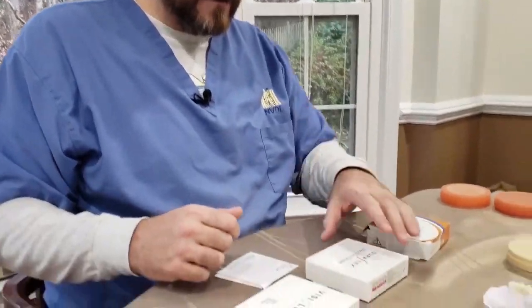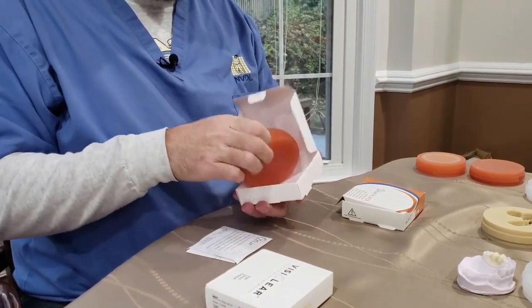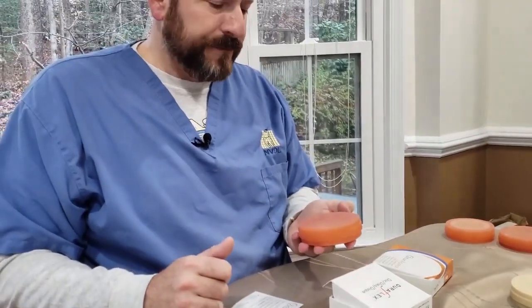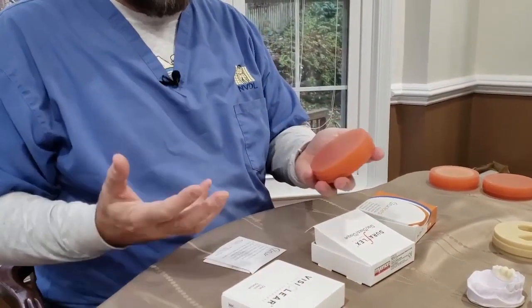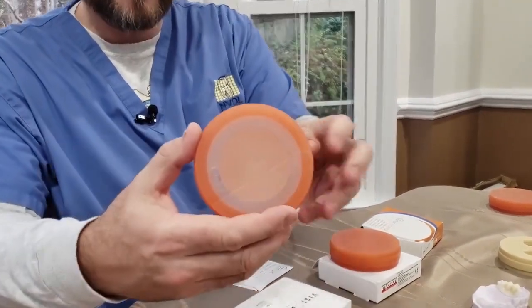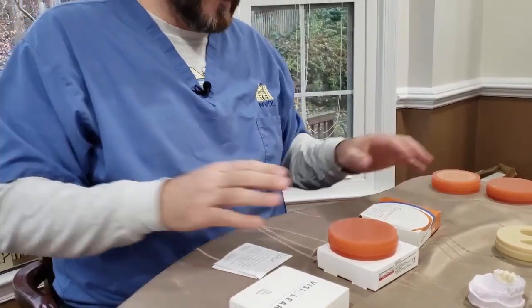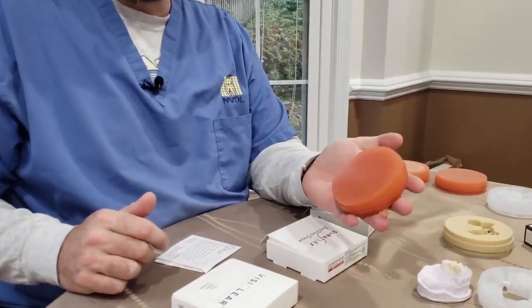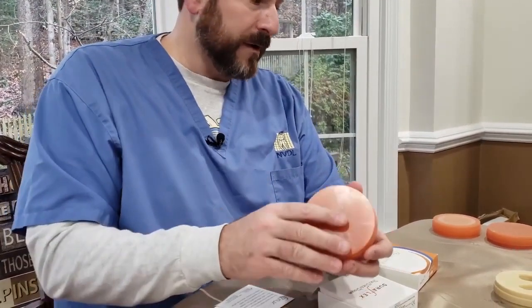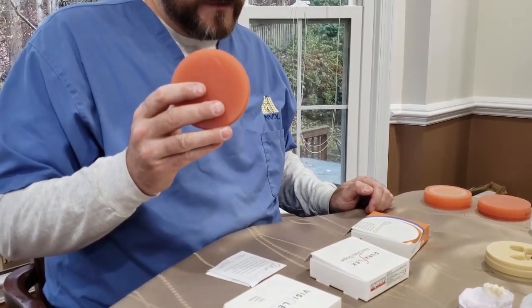From that we jump to our DuraFlex. This material is pink — a more translucent pink, very flexible. It looks kind of stark pink, but as you thin it out you can see it gets nice and pale and blends in nicely. This material is used for flexible frameworks as well as clasps with a tailpiece that you can embed in acrylic. Crown and bridge is really out — you're going to make a pink tooth or something like that. So this is strictly on the removable side, for frameworks and clasps.